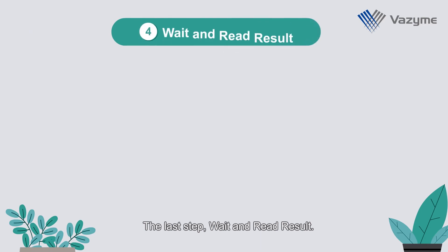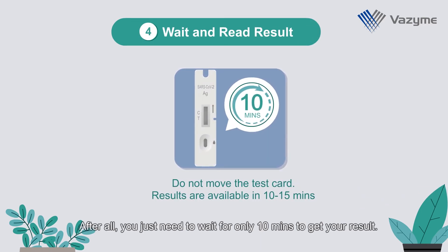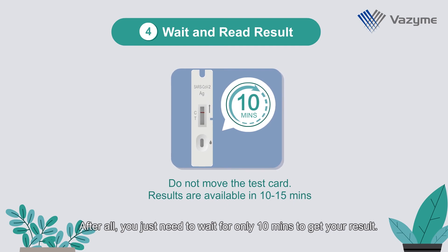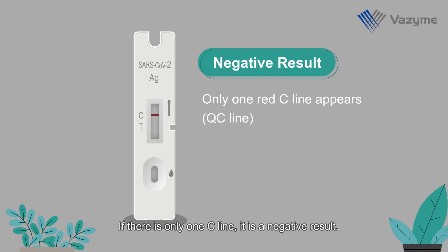The last step: wait and read the result. You just need to wait for only 10 minutes to get your result. If there is only one C line, it is a negative result.